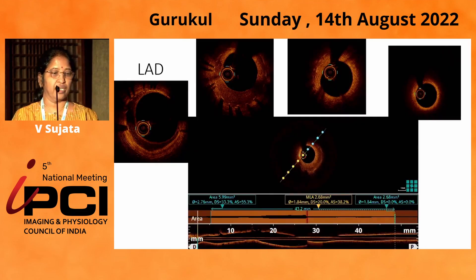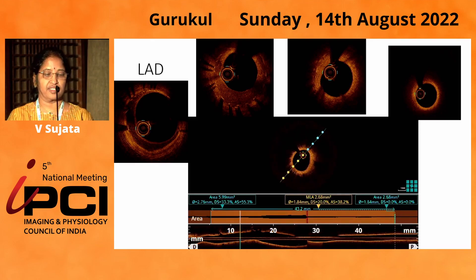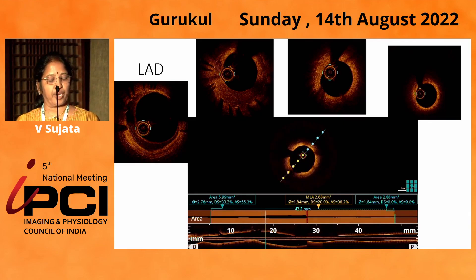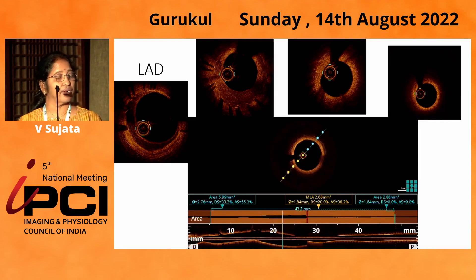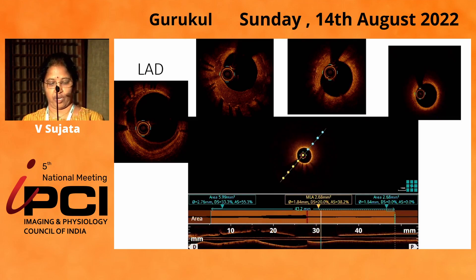So we did imaging. You can see there is a restenosis in the LAD. In the middle picture, there are two stent struts, and you can see there is intimal hyperplasia. In the rightmost picture, there is also a lipid plaque — you cannot see beyond the stent strut.